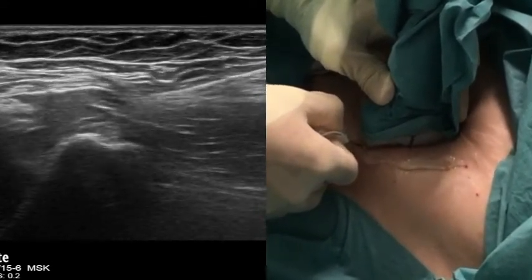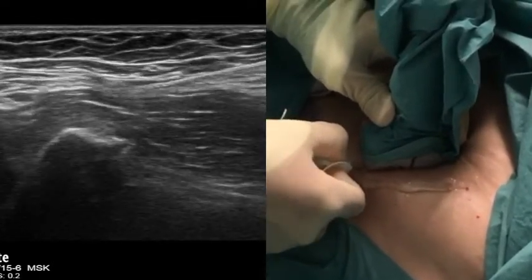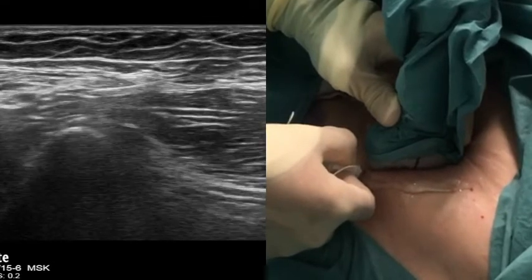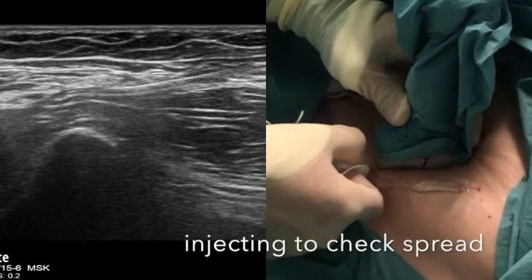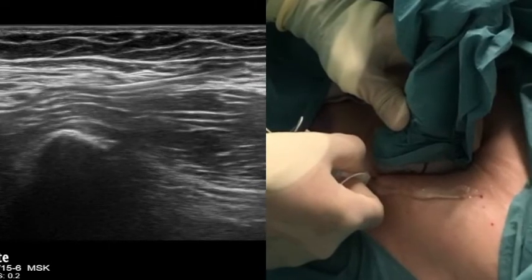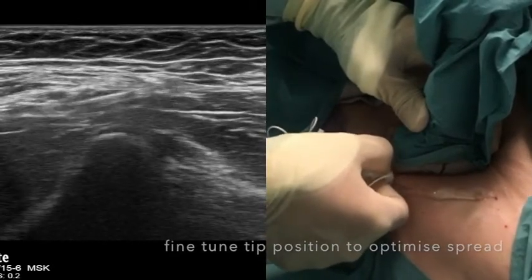Advance the needle only when you have good ultrasound vision of the tip. There will be some tough fascia layers through which you must pass, and you can get a sense of when these pops occur in this video. Notice that there is an artery near the needle tip in this block which must be avoided. When you think you are beneath the iliacus fascia, aspirate and inject one mill of local anaesthetic and assess the spread on ultrasound. If you do not see clear separation of the muscles on injection, make fine adjustments to the needle tip position and try again.